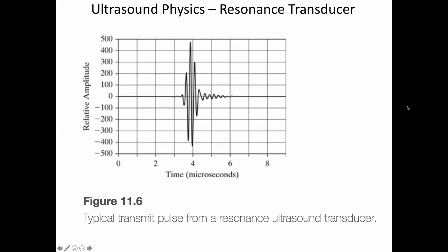Oh, you sweep through the whole field of view. I guess this was a while ago. We had a slide on that. So basically you change the phase array such that the direction of the beam changes. One imager and one focused ultrasound device. Yeah, I don't know. That's a great question.